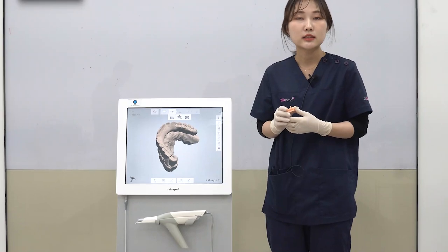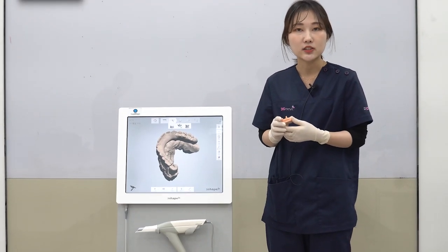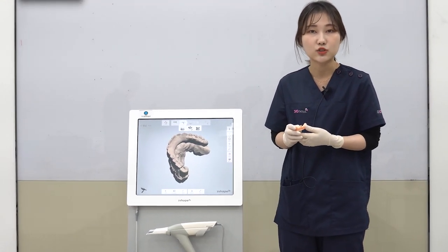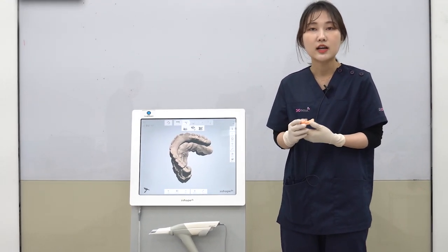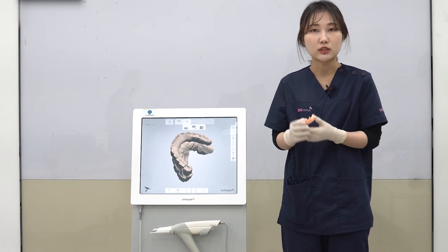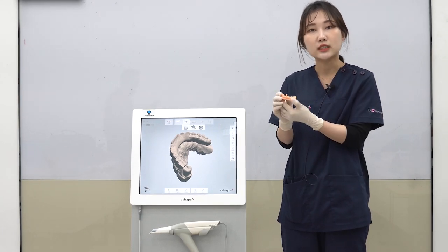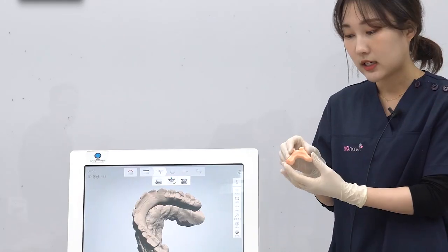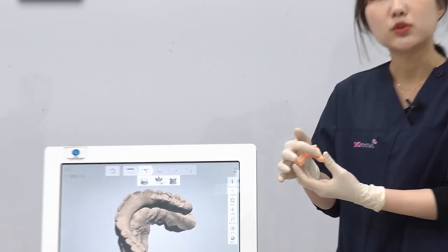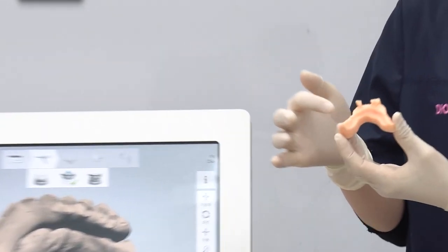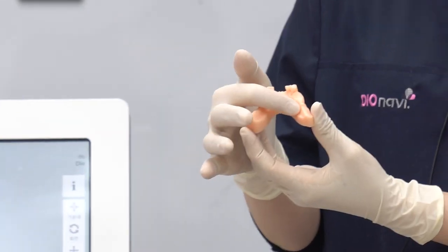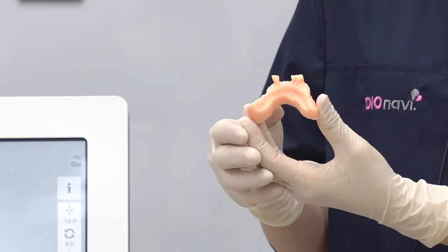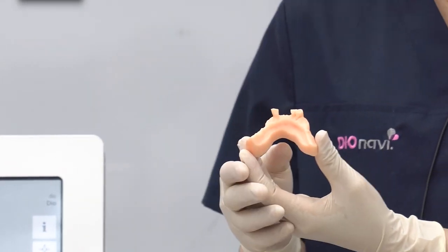Next, I will show you how to scan the area where the implant is going to be placed. Before scanning the implant location, you must attach resin. The criteria for attaching resin is to place resin around the gum area, not where there are teeth.